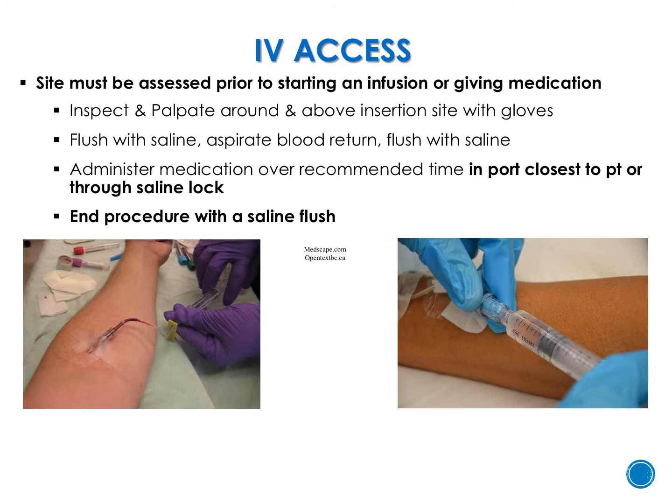Then a part of checking to make sure that the IV line is actually patent is flushing. So you will take a syringe into the room with you. Most facilities have pre-filled syringes, and a lot of times they're a 10 milliliter syringe. You are going to start with a flush, maybe about 2 to 3 milliliters of saline. So you flush the tubing first. If it flushes well, if you don't feel any resistance, that's a good sign that the IV catheter is still in the vein. Then you pull back.